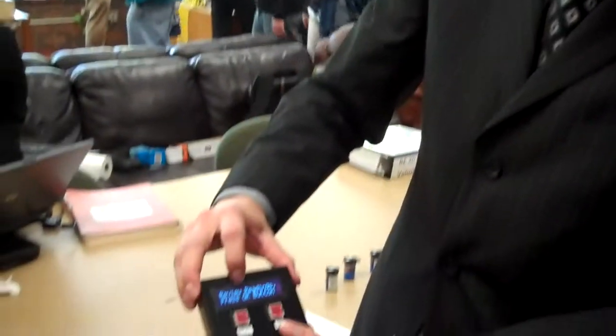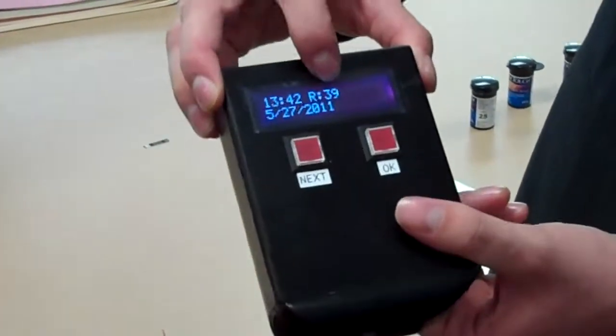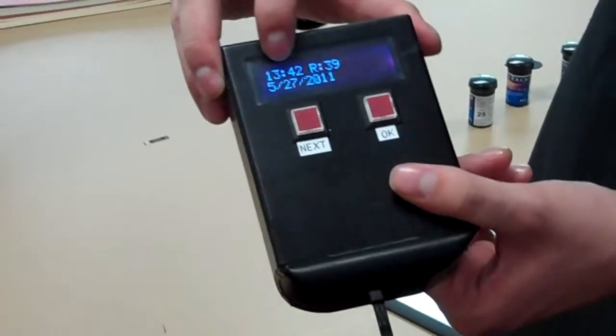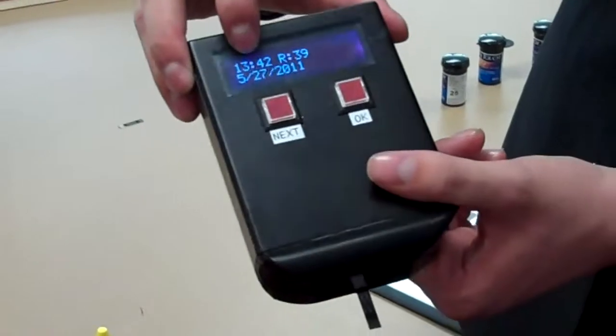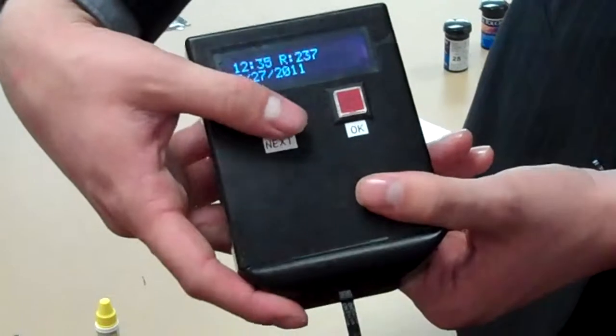So I hit next, and now I can review my readings. You can see that was our last reading right there. It gives it a time stamp in military time so we can tell all throughout the day what time it happened and the time of day. We can cycle through here and see all of our old readings.